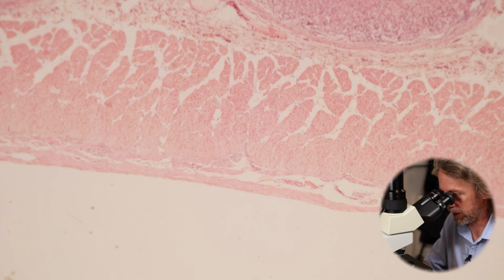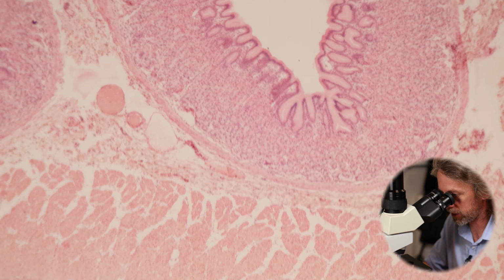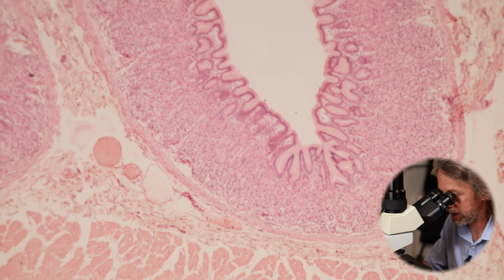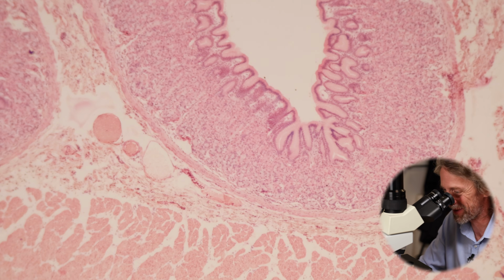That's like the shiny bit. Then we've got the muscle, and then we've got submucosa, a little bit more muscle. Lamina propria there is kind of mixed up with the epithelium. It looks like I'm not talking rubbish. It does look like it's got the same layout as the esophagus.